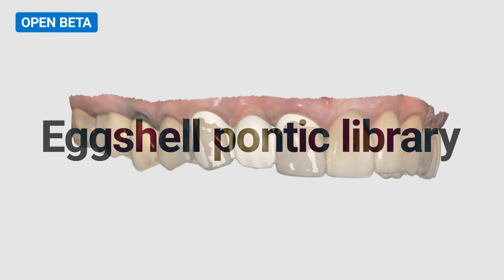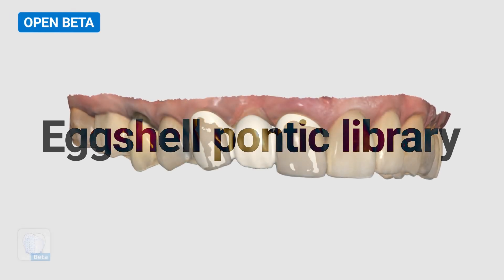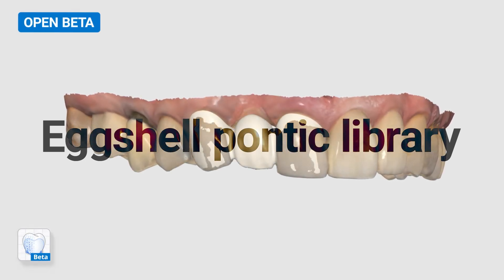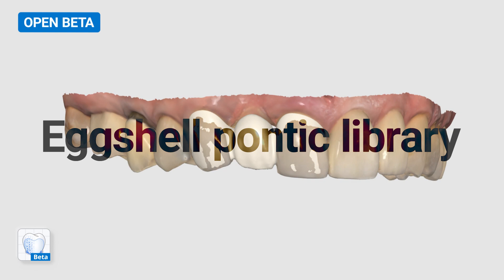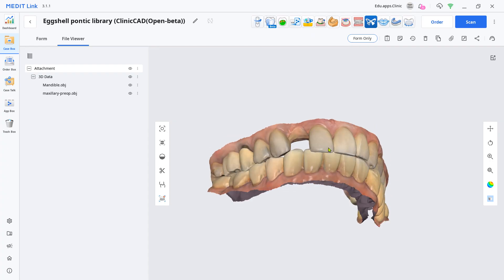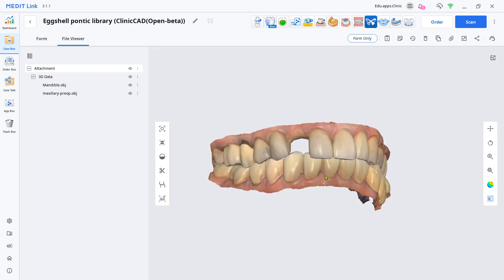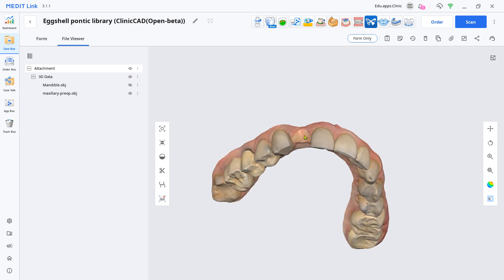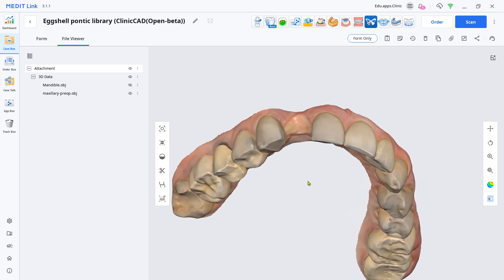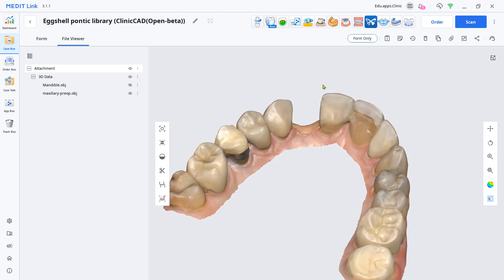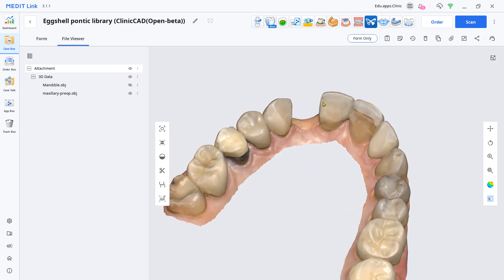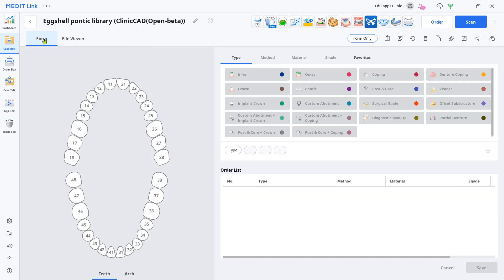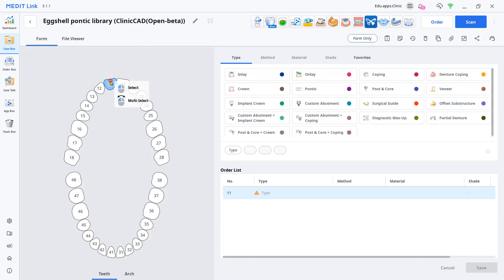This is a quick guide on how to design an eggshell bridge when there are missing teeth with the Clinicad app. Even if there are missing teeth, you can design an eggshell temporary bridge from the Pontic Library. Go to the Form tab and fill out the form just as usual temporary bridge case.